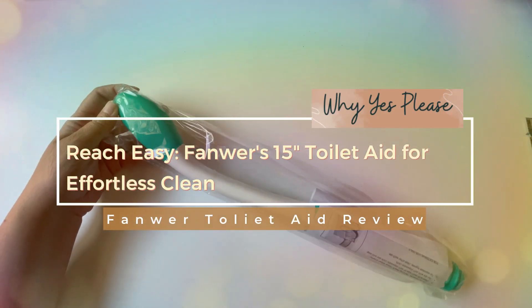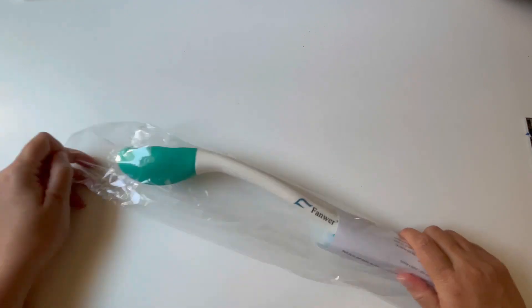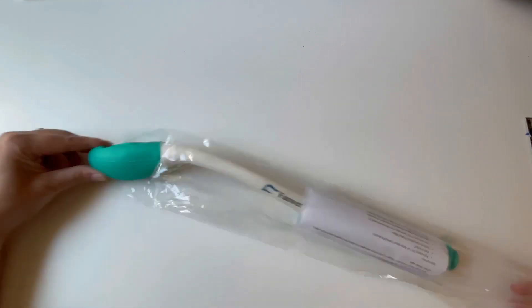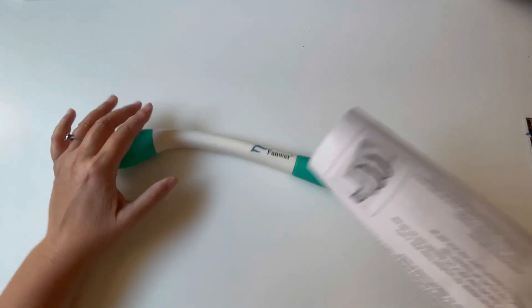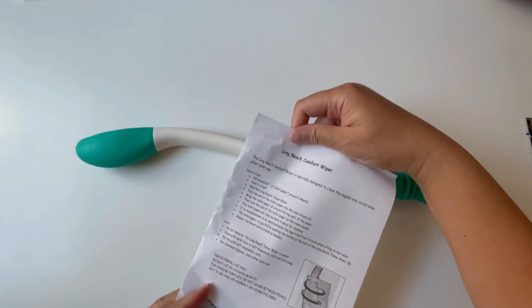Hi friends, this is the Fawner Toilet Aid Tool. This tool was designed specifically to help you reach from the back or the front to wipe yourself. I got this in exchange for an honest review.